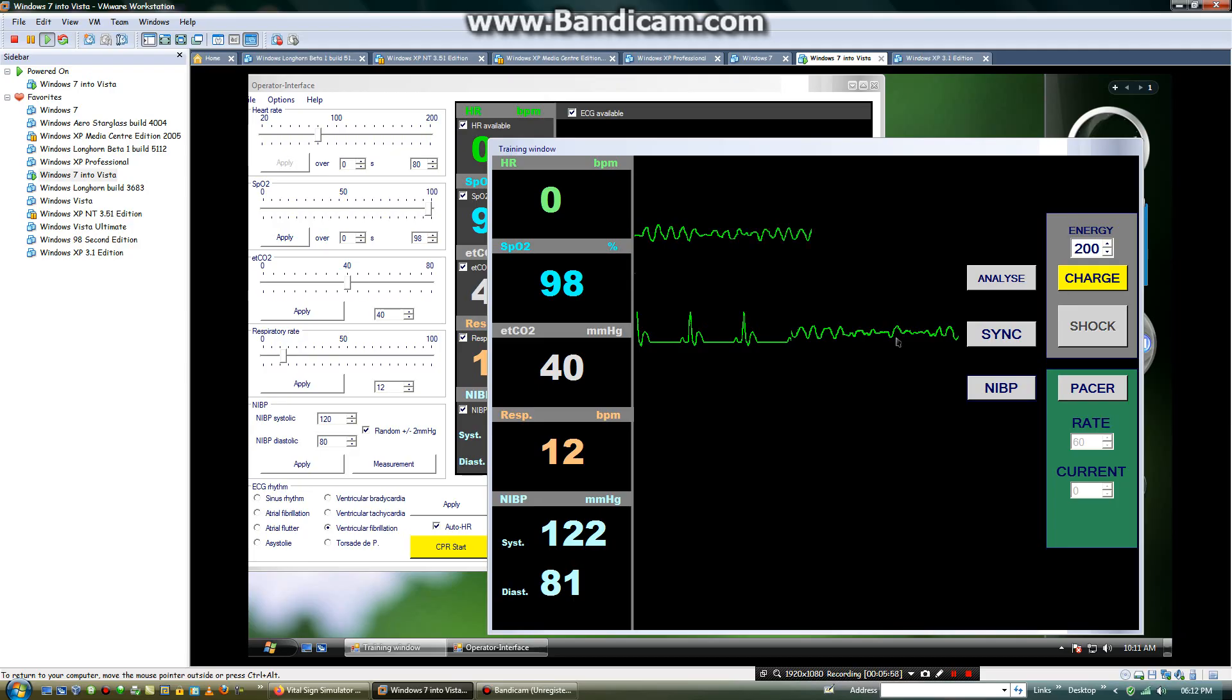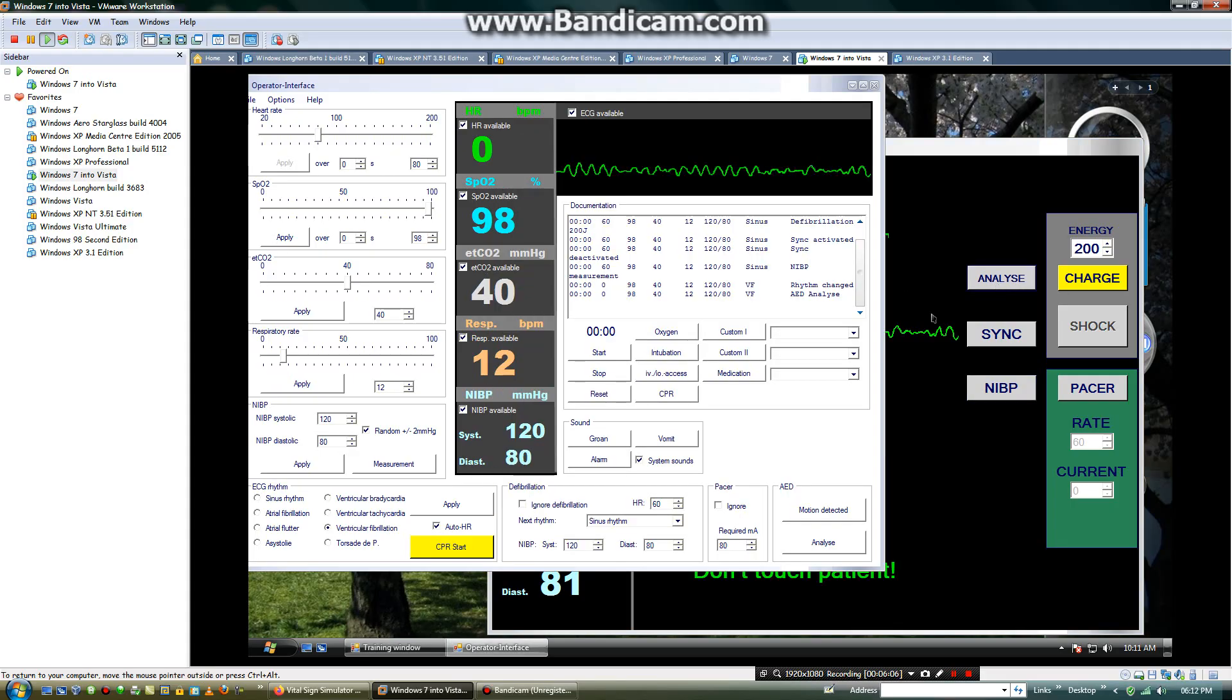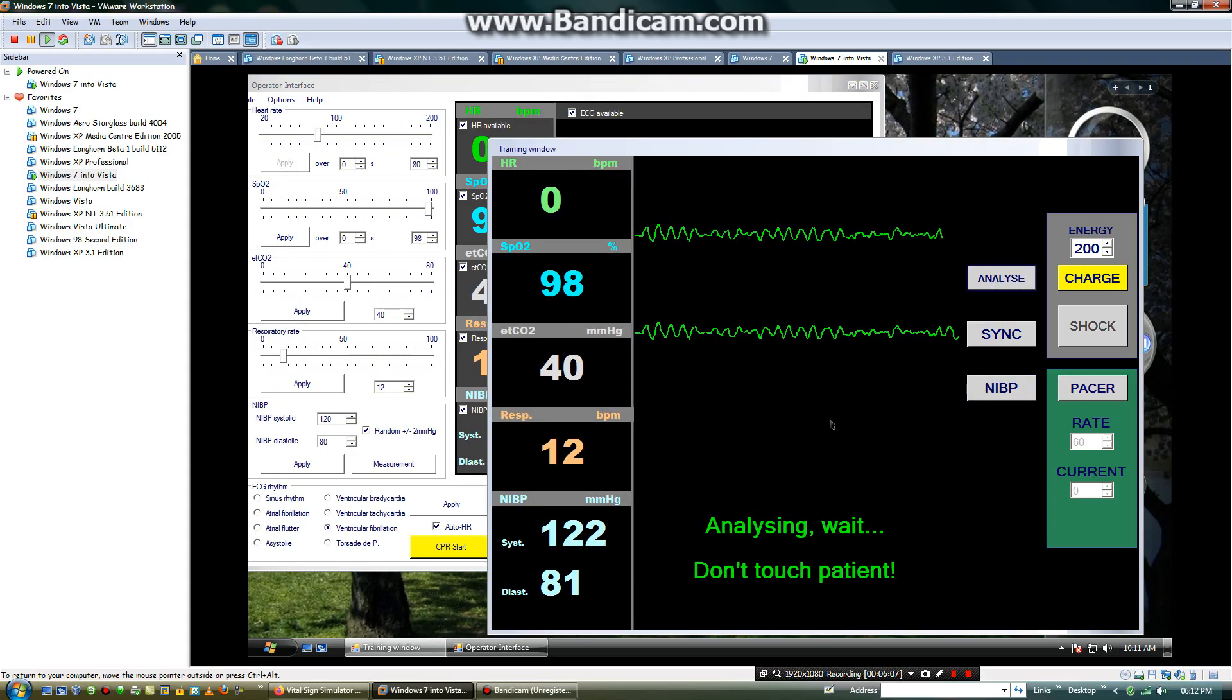Then you will analyze the monitor, I mean the defibrillator. Analyzing now. Stand clear.